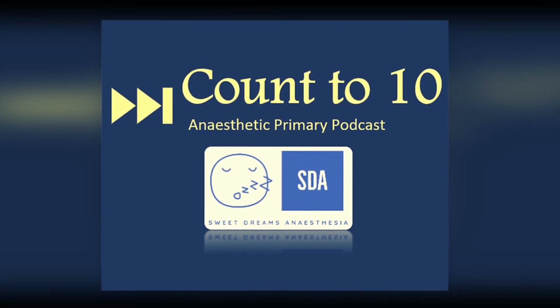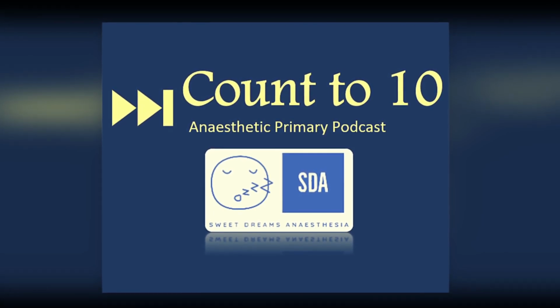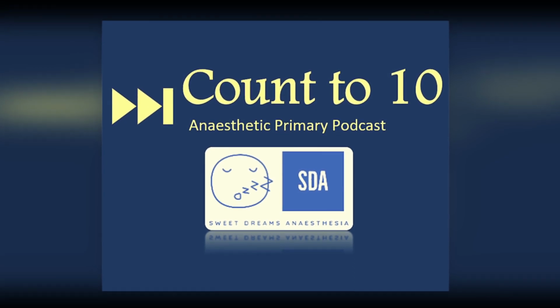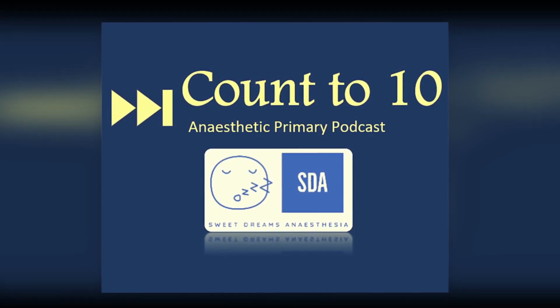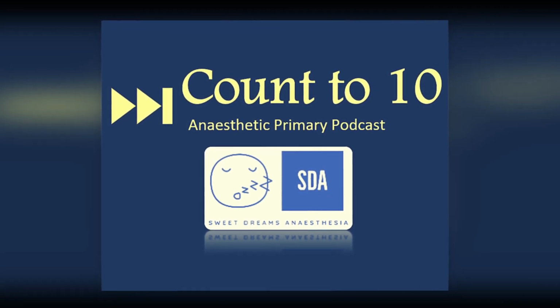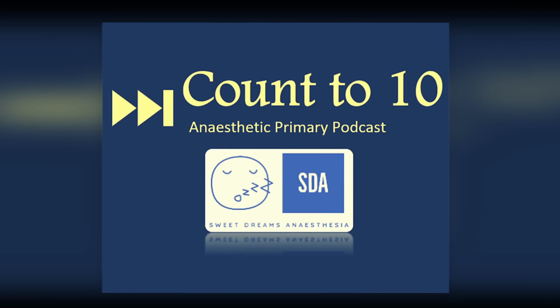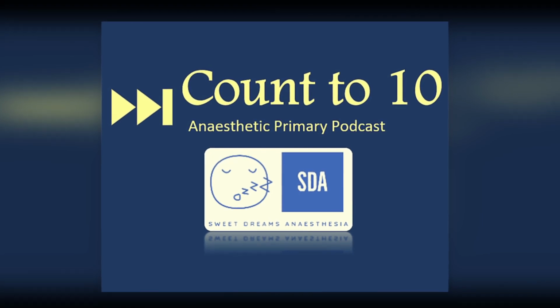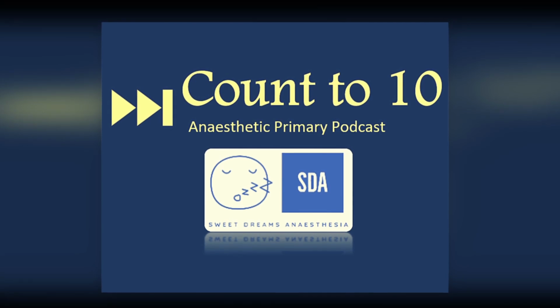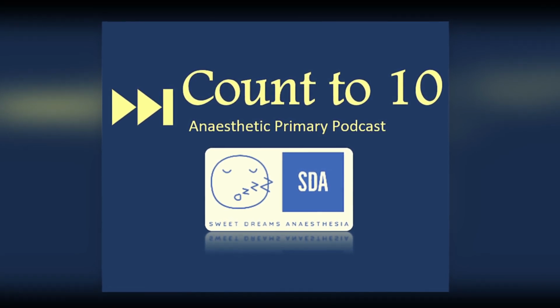This is commonly referred to as the R equation or the R value, and unfortunately you do have to know this equation for your SAQ answer. This R equation is complex to say in the podcast format, but it's calculated using the AC absorbance divided by the DC absorbance for the red light over the AC absorbance divided by the DC absorbance for the infrared light.